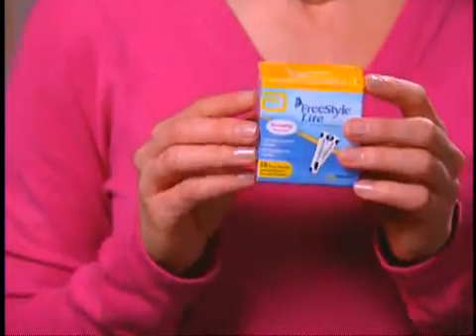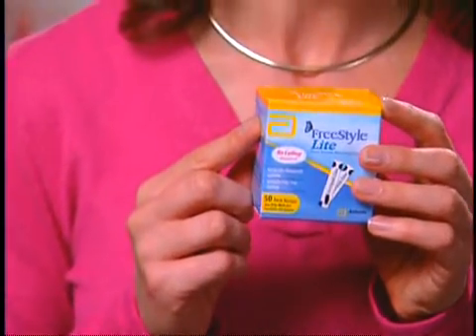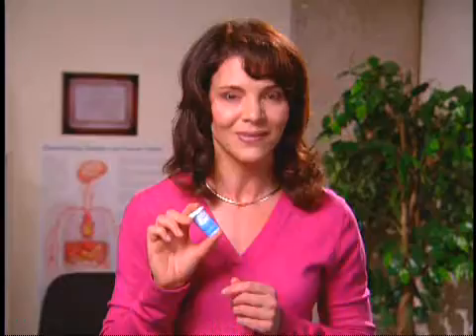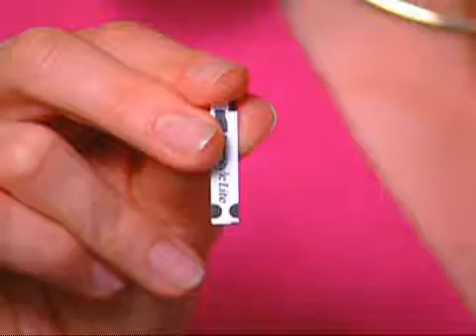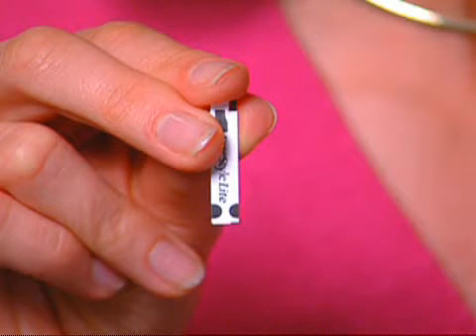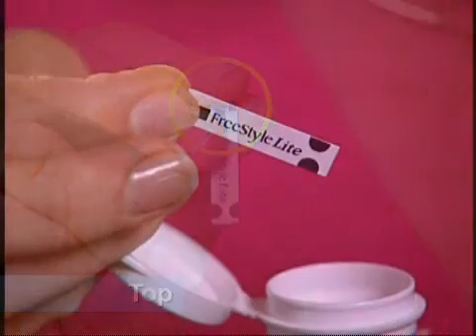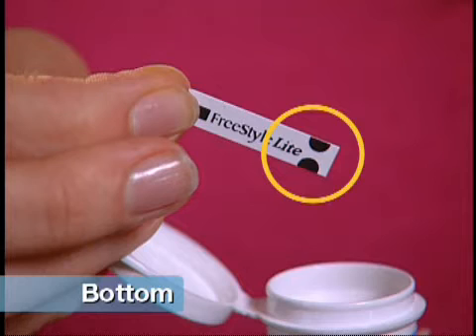Now, let's look at the test strips. It's very important to remember that the FreeStyle Lite system should only be used with the FreeStyle Lite test strips — if you use other test strips on the meter, it will not power on. Next, we'll remove the cap on the test strip vial and take out one FreeStyle Lite test strip. Always be sure to replace the cap when it's not in use. This is the front of the FreeStyle Lite test strip. At the top of the strip, you see a black test strip symbol, and at the bottom, you see two rounded half circles.